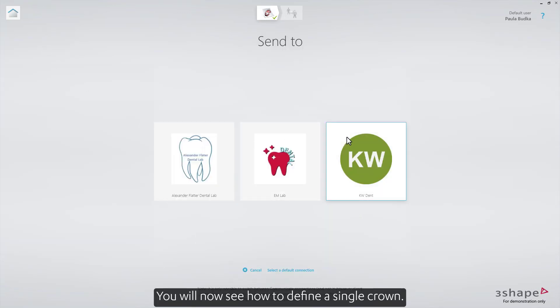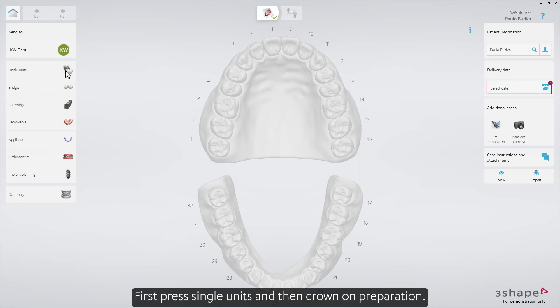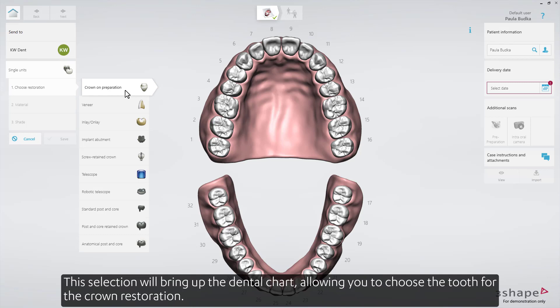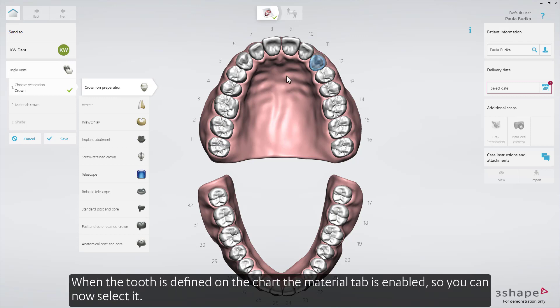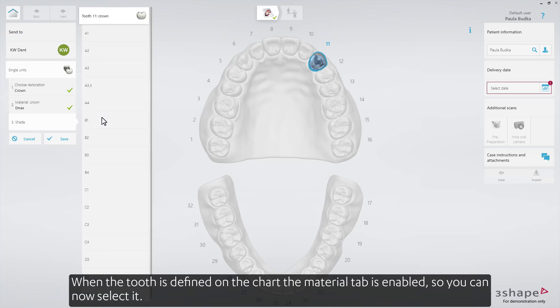You will now see how to define a single crown. First press Single Units, and then Crown on Preparation. This selection will bring up the dental chart, allowing you to choose the tooth for the crown restoration. When the tooth is defined on the chart, the Material tab is enabled, so you can now select it.